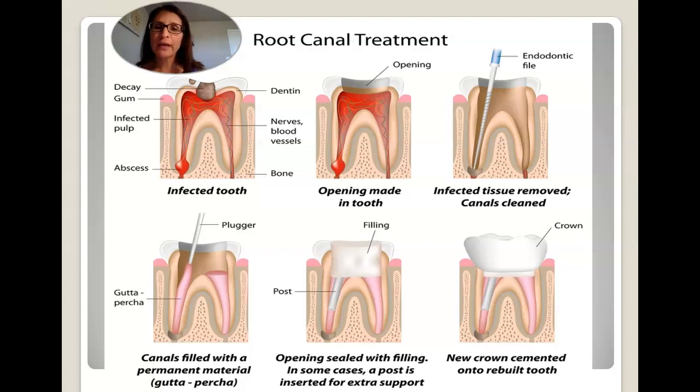When it comes to root canal, there's a series of steps that are going to occur, and it's very important that as a dental assistant you know what those steps consist of and what is occurring in each one. So with the root canal, again, it can be done by a general dentist if he or she chooses to, or it can be done by an endodontist. It typically can be completed in 2 appointments.